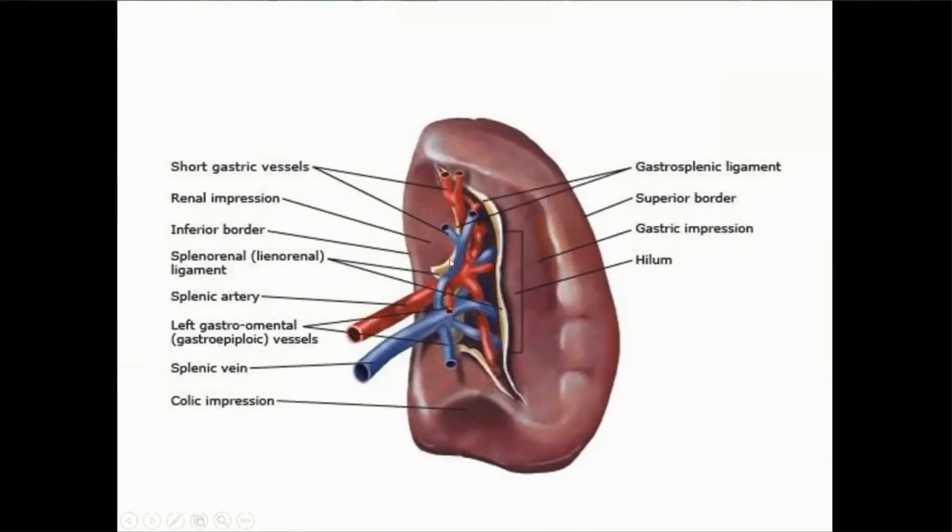In the middle of the spleen, you have a really big vascular bundle. So you have the splenic vein, and then you have the splenic artery. And this can get really tortuous as you get older. Mine is probably becoming tortuous, hopefully not too bad yet. And you can get nice aneurysms off of this as well. So little splenic artery aneurysms. And then the nice parenchyma of the spleen.